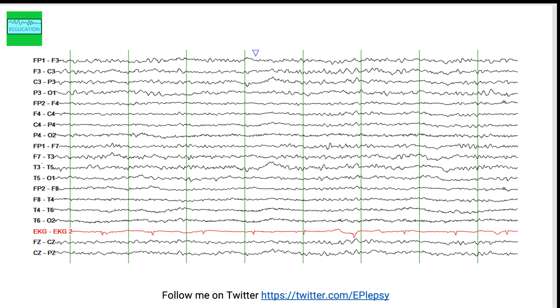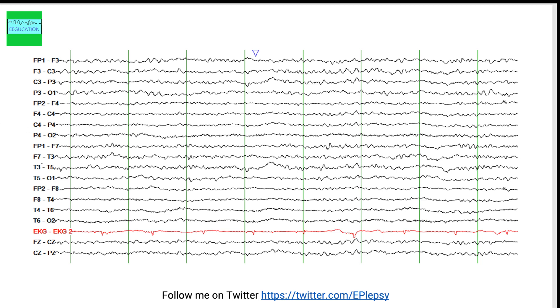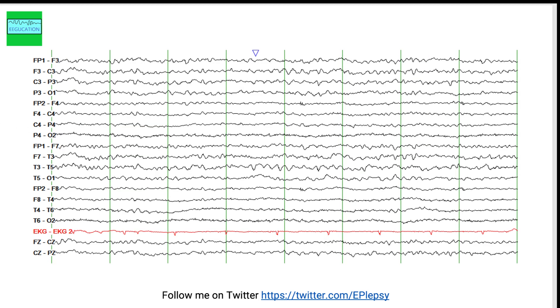As with any part of the neurological examination, you compare the left side to the right side. Similarly, when you compare the left side with the right side here, you see an asymmetry. The amplitudes on the right hemisphere are lower than the amplitudes on the left side. There is also a richer mixture of frequencies on the left side. This is the same EEG — just an additional sample showing that asymmetry between the left and right hemisphere.